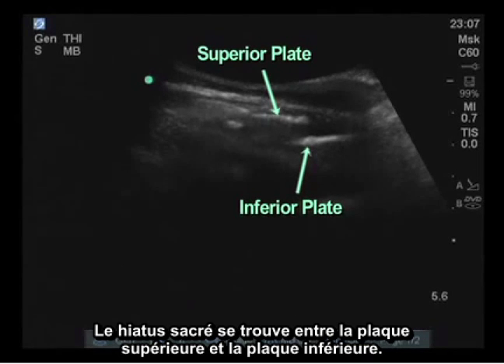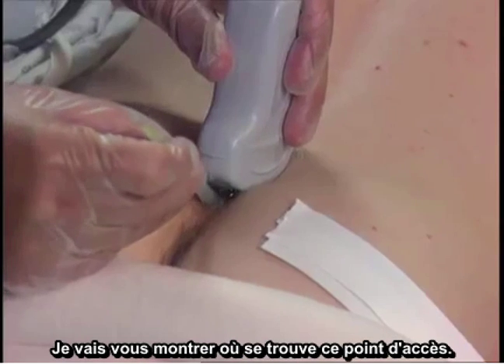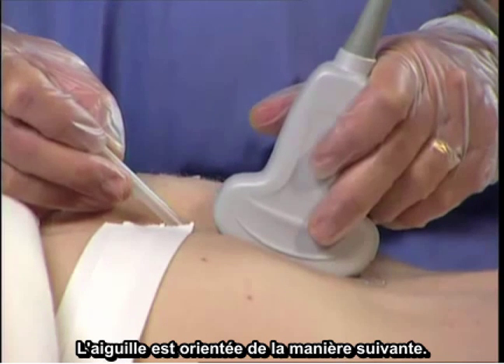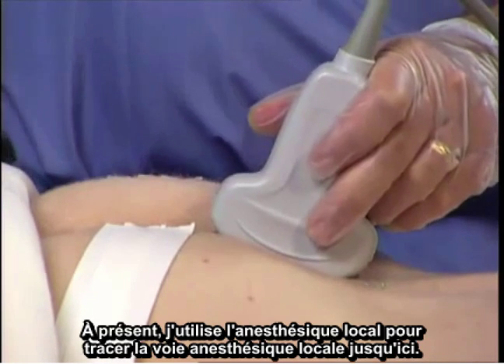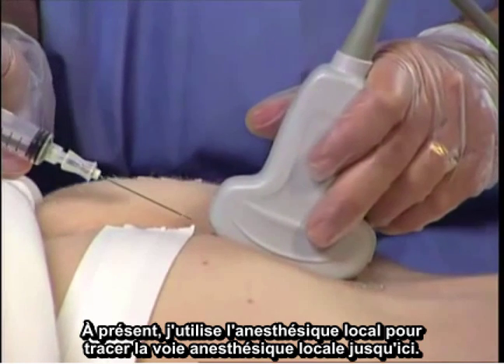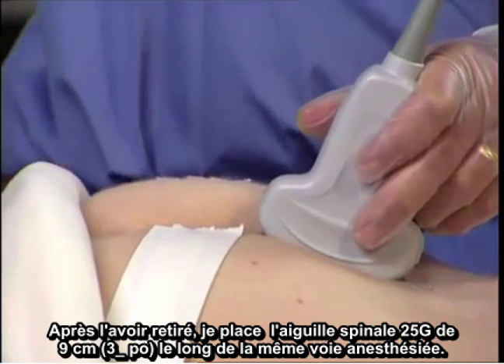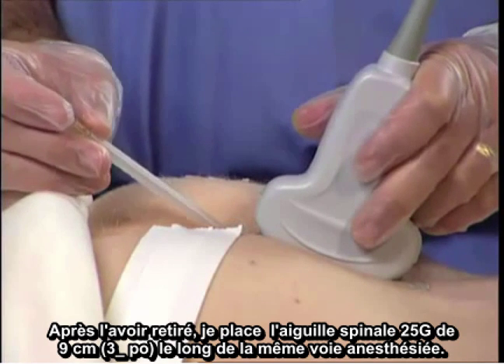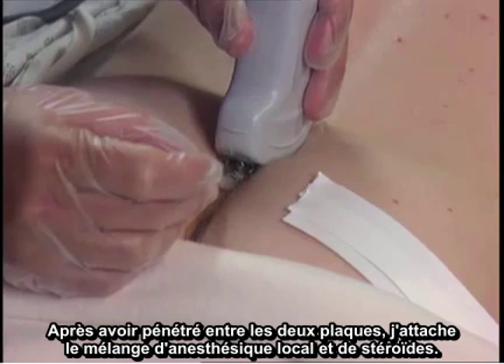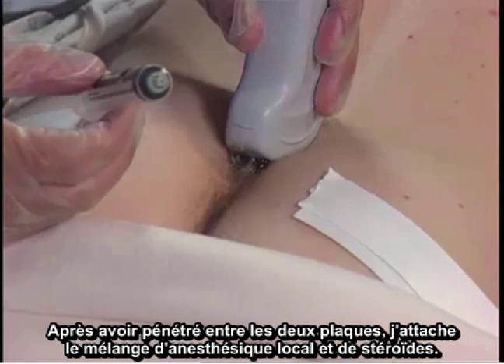The probe is moved caudally and very clearly the sacral hiatus comes into view. There is a superior plate and an inferior plate, and in between them is the sacral hiatus. I'll demonstrate where that access point is. The needle is angled thusly. At this point I would utilize the local anesthetic to perform a local anesthetic track down to this level. Removing that, I would then place the 3½ inch 25 gauge spinal needle along the same anesthetized track.